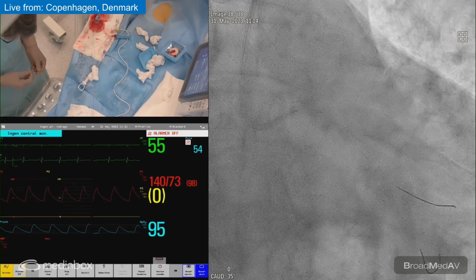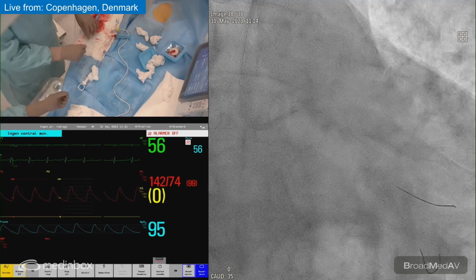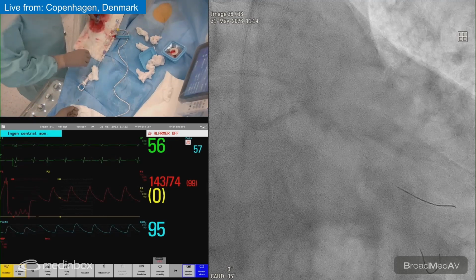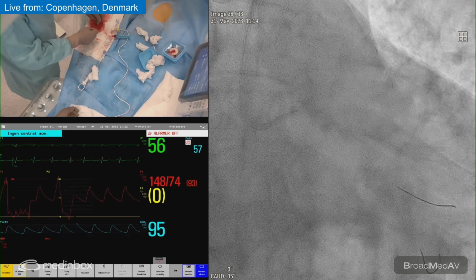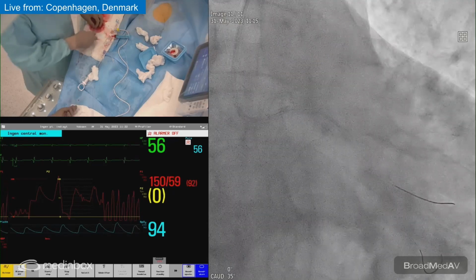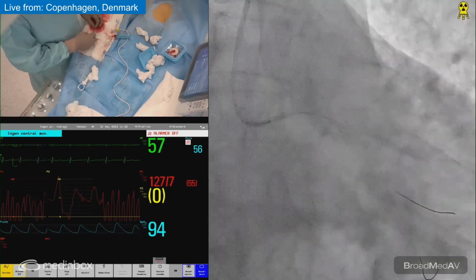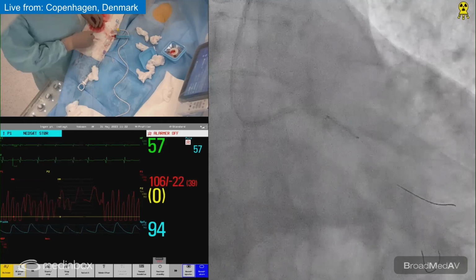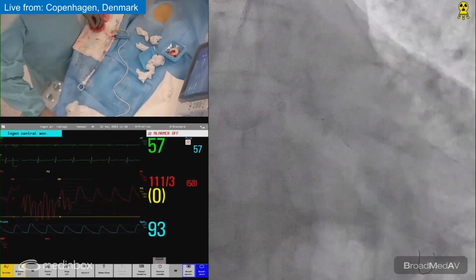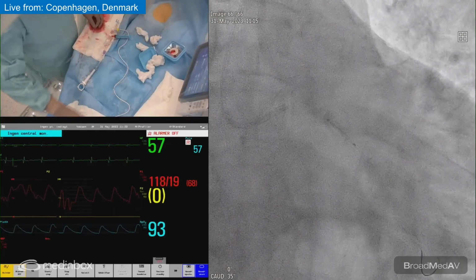As you just saw, Frans retracted the wire a little bit, so it was actually moving freely. So it's not that jailed, but we don't want to jail it behind two stents. And now the stent is down, and now the other wire is retracted.